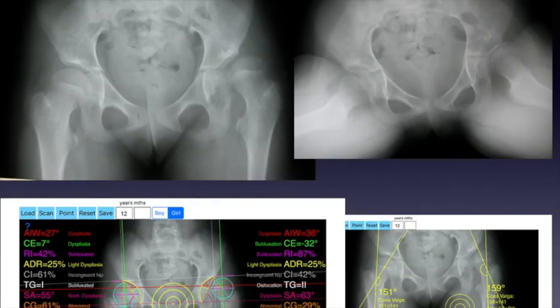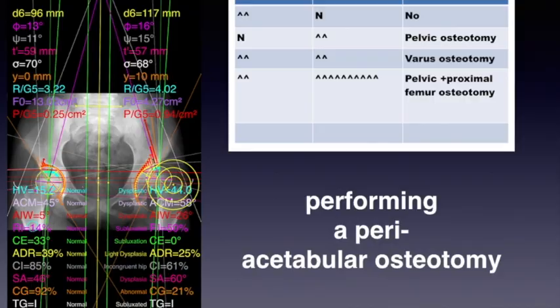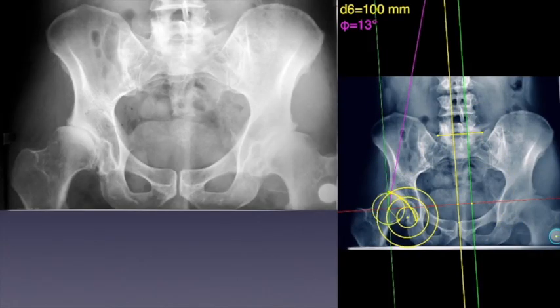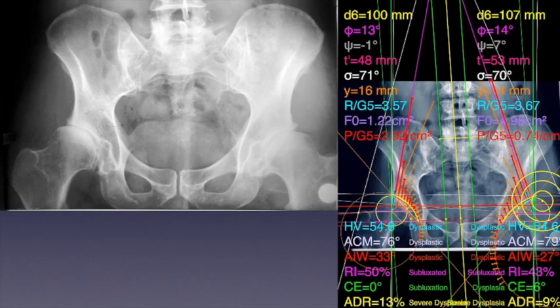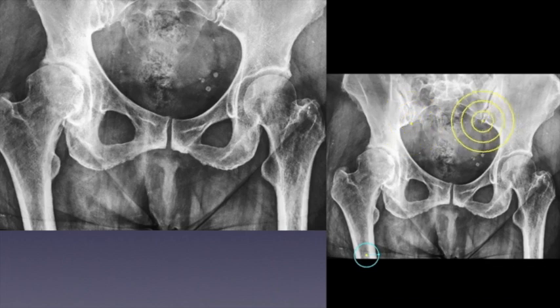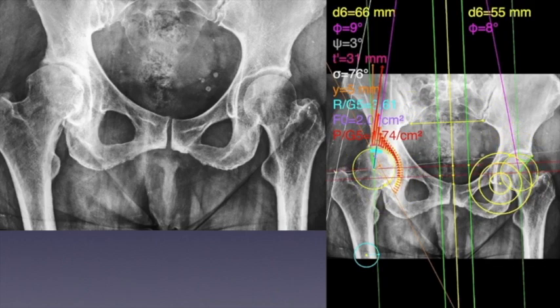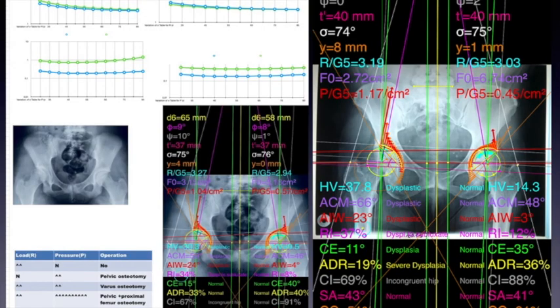The classic standard way is the manual measurement with protractors, rulers, well-sharpened pencils, and transparent paper, to draw and calculate and weigh all these indexes, in order to have a diagnosis of what is pathologic and what is normal of the measured values. Every value has been compared by age, gender and site-specific reference from textbook databases by the user in an effort to evaluate the result in the most objective way.